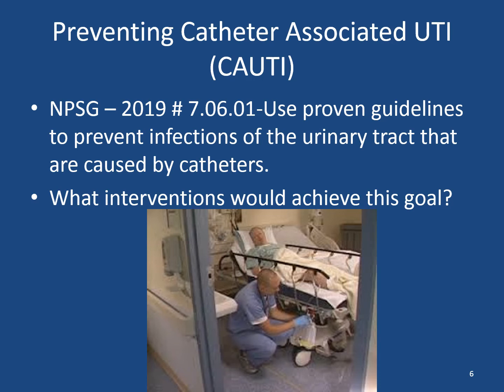We want to insert using that sterile technique, the aseptic technique, to prevent the introduction of any pathogens. Use the smallest size possible, because if a catheter is too large, it can cause skin tears and damage while going in. Any breaks can have an increased risk of infection at that site.